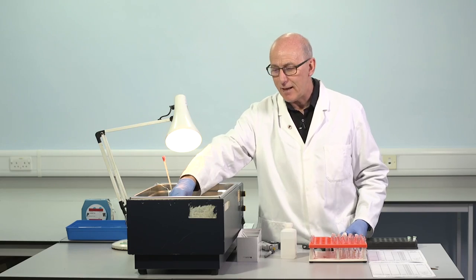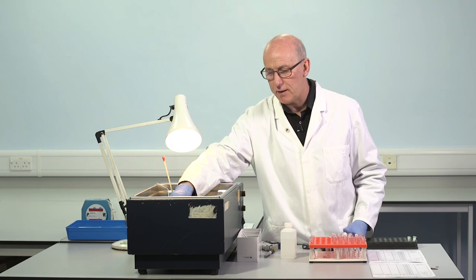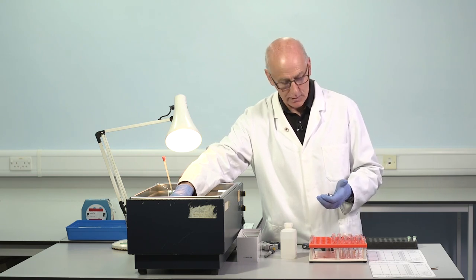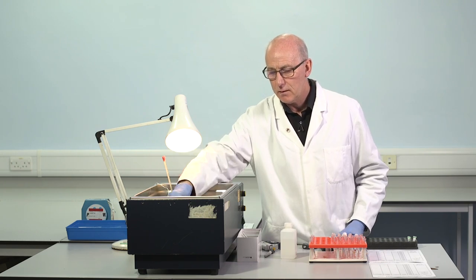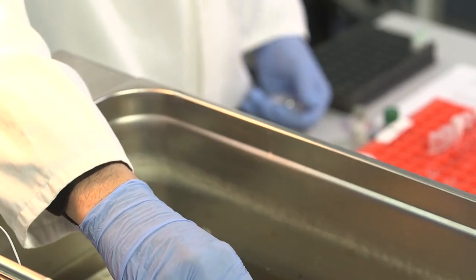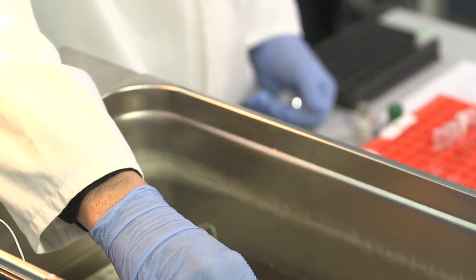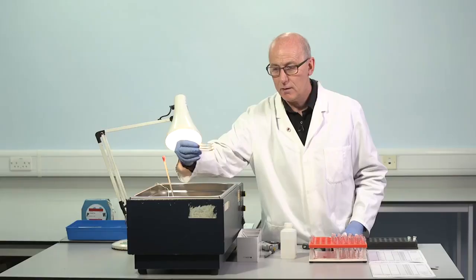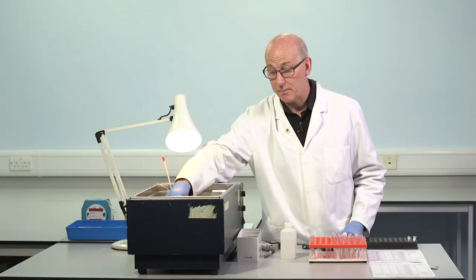So now we have a balance between maintaining the temperature of the incubation mix whilst the tubes are immersed, but at the same time we also want to observe in order to record the clotting time. The recommendation is that this tilting should be 3 times every 5 seconds through an angle of 90 degrees. And that's what I'm now trying to do.